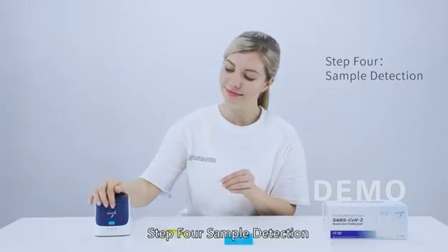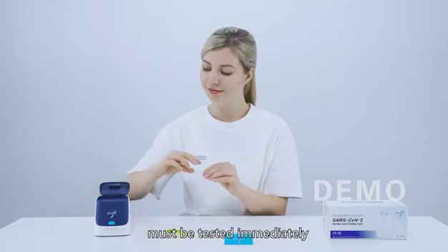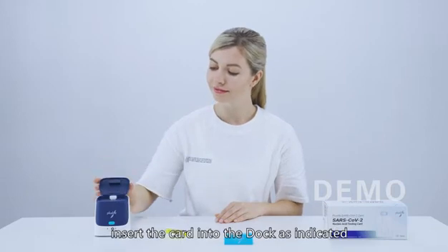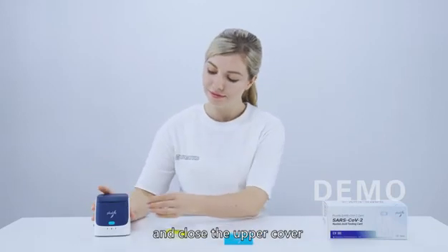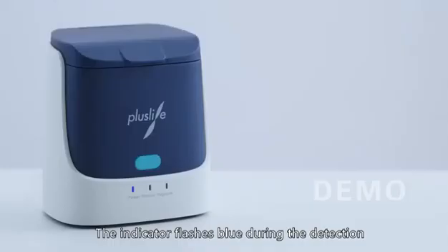Step 4 - Sample Detection: The SARS-CoV-2 reaction card must be tested immediately. Open the upper cover of the mini dock, insert the card into the dock as indicated, and close the upper cover. Press the power button to start detection. The indicator flashes blue during detection.